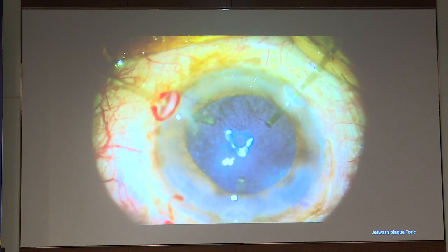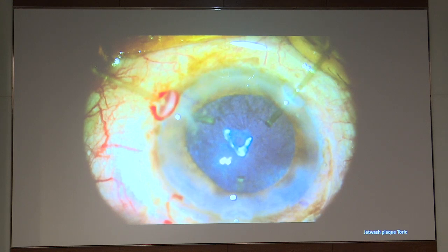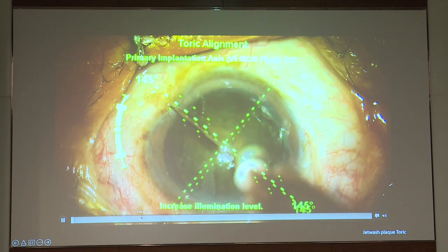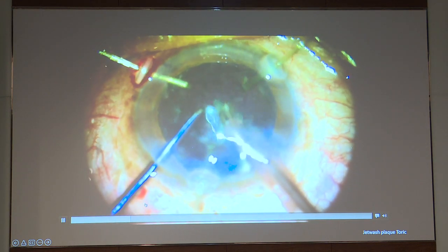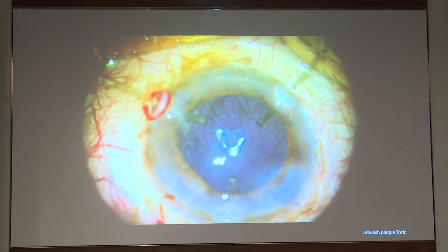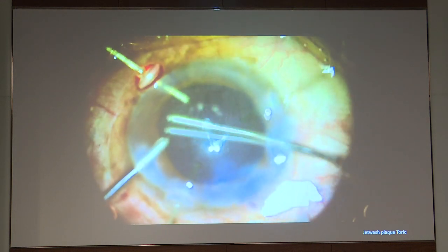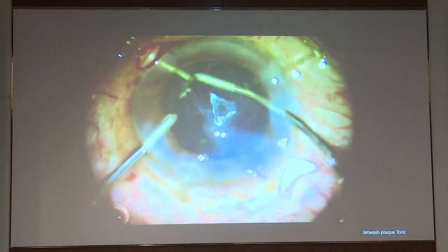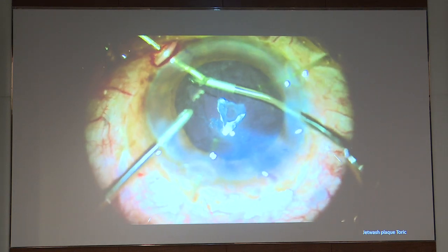So at the end of this process, we were left with a bag which was very friable, had lots of plaques, and we set about trying to get those plaques out. And obviously, since they were nicely stuck doing the cortex extraction, we had to keep trying to polish it and peel those plaques, and it was a little tough because you could increase the dehiscence at any point, you could break the PC.